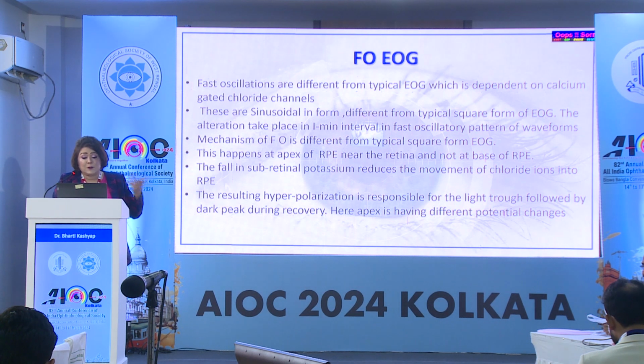The resulting hyperpolarization is responsible for the light trough. There it was a light peak. Here it is a light trough followed by a dark peak. There it was a dark trough during recovery.